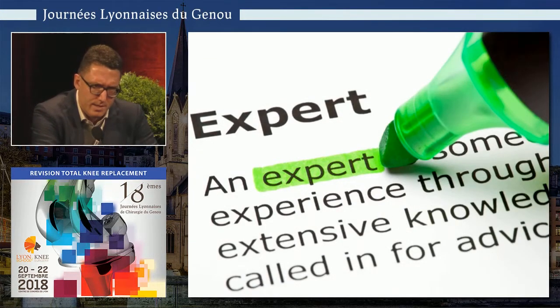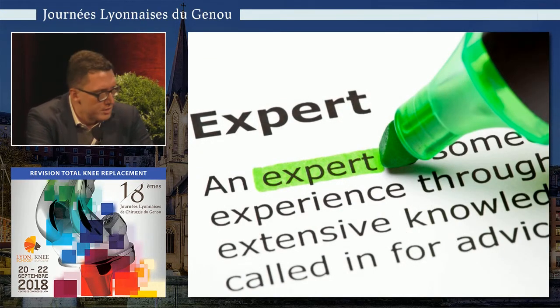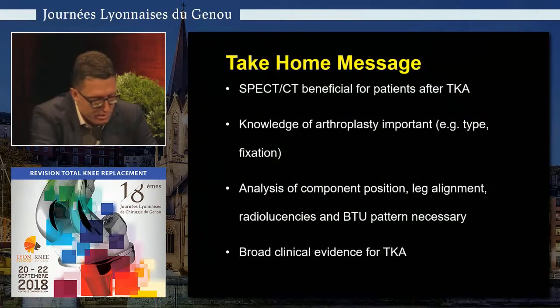At the moment, SPECT-CT is still an expert tool, so you really have to sit together with your MSK and nuclear medicine physician, discuss the findings and then find the perfect diagnosis. It shouldn't be just looked at as hot or not, and this is something I really would like to highlight here.